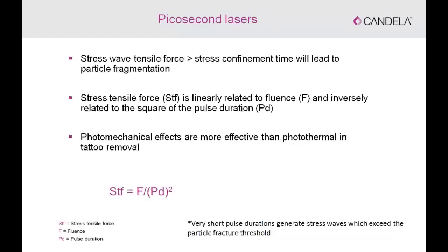So I will spend a couple of minutes explaining this slide, because I think this slide is the key important slide in understanding why the picosecond lasers are better than the nanosecond lasers when it comes to tattoo removal. And I'm just spending a few slides on tattoo removal, and then we'll move on to the pigmentation.